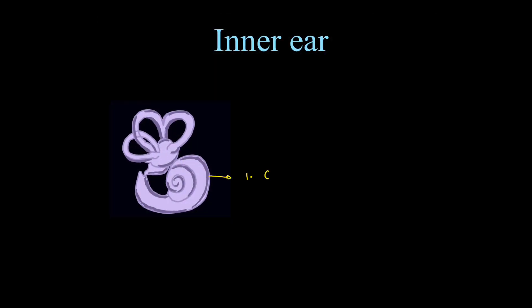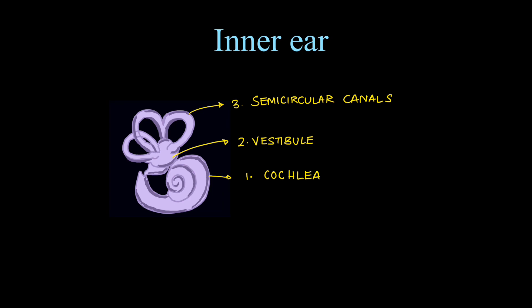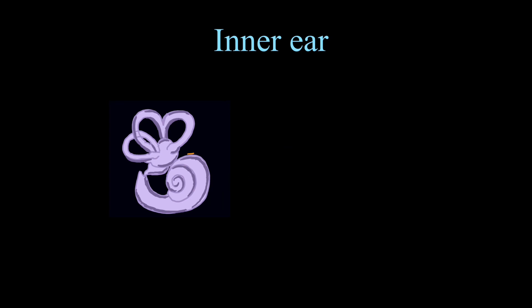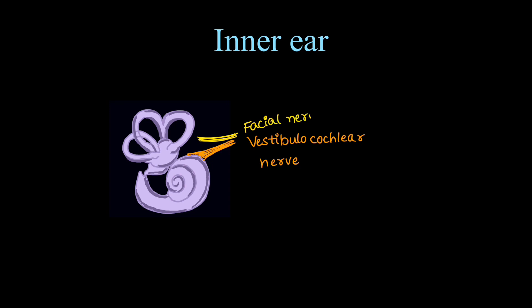Moving on to the inner ear, it has three parts: the cochlea — the rounded portion; the vestibule — the bulbous part; and three semicircular canals. We will see all these structures on axial HRCT images. These portions are very neatly seen; we can also see the vestibulocochlear nerve along with the facial nerve forming the 7-8 nerve complex.